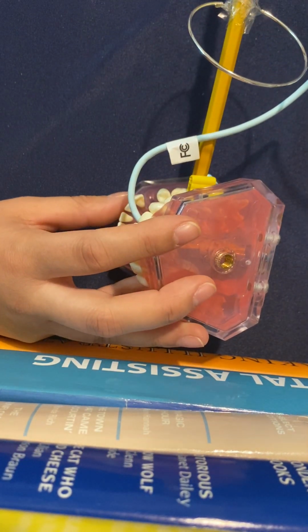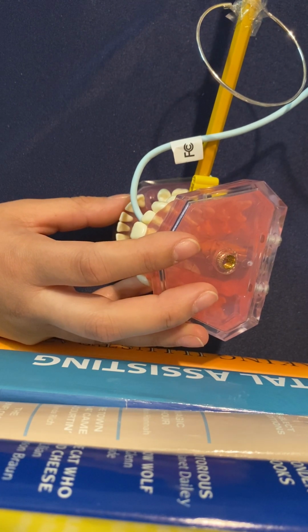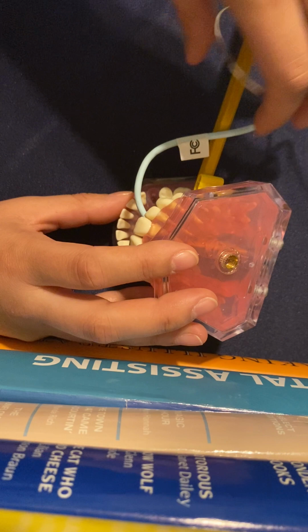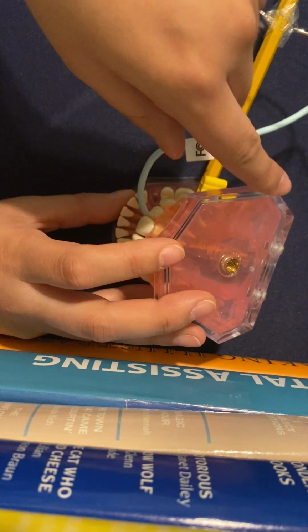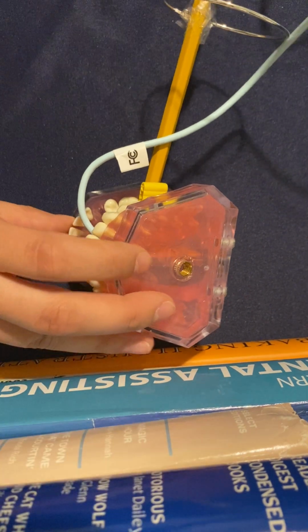And you're going to want to direct the center point down from the outer canthus, the corner of the eye, to the mid-cheek area. So pretend, like I said, this is his nose. There's kind of a cheek area here. So you're going to want to point down.